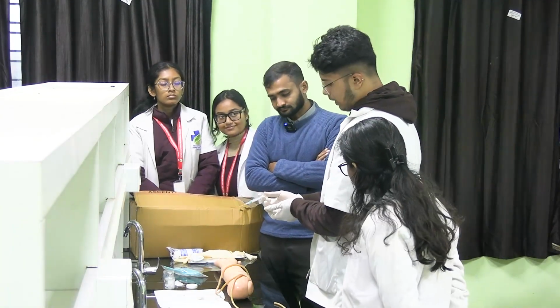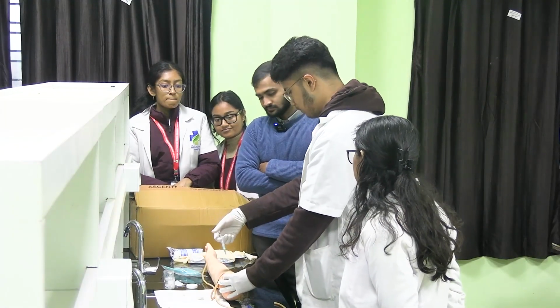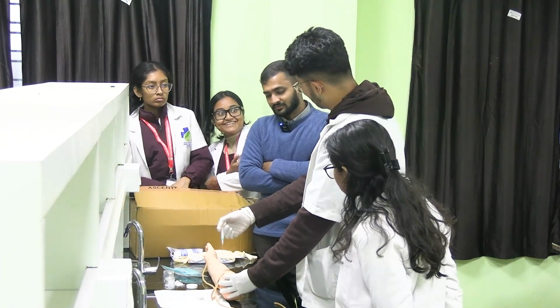In case of SC, sir, everything will be the same. It's just that while doing it, I will use the pinch method and then I will take the angle from 45 degrees to 90 degrees, sir. 45 degrees. Sir. 45 degrees. Okay.